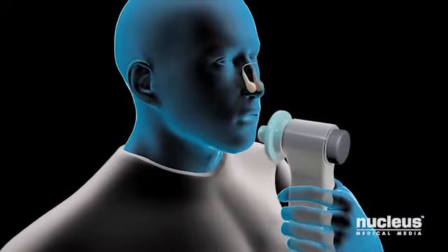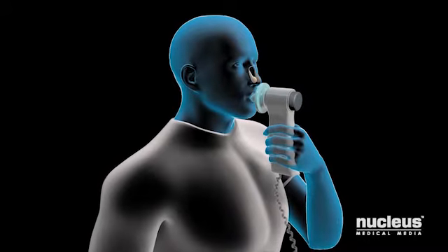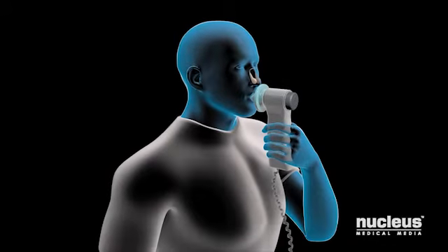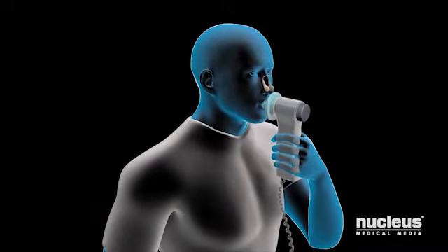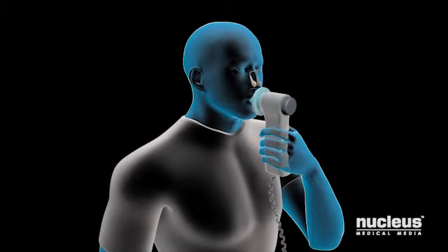You will place the spirometer's mouthpiece between your teeth and tightly seal your lips around it. Finally, you will blast the air out of your lungs as hard and as fast as you can. Your caregiver will tell you when to stop.